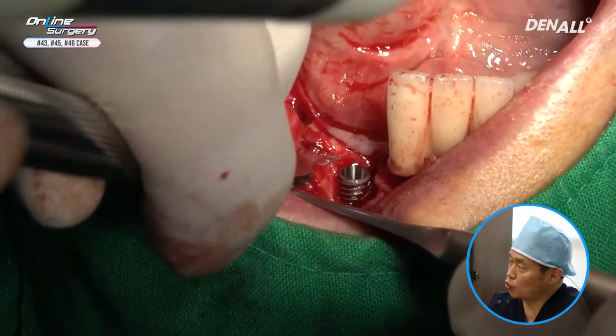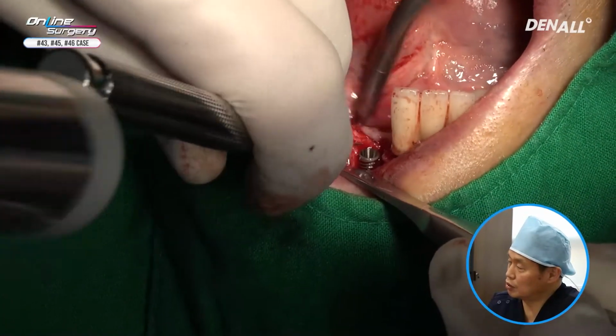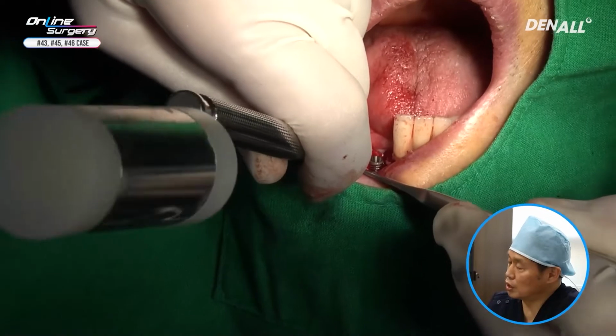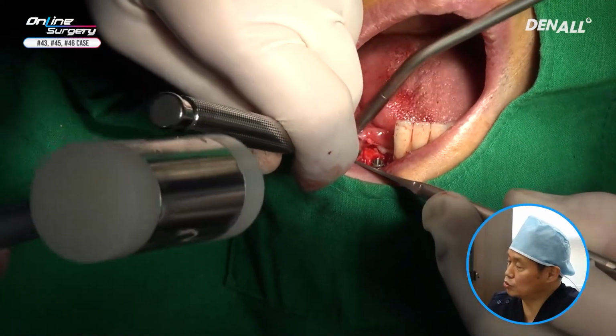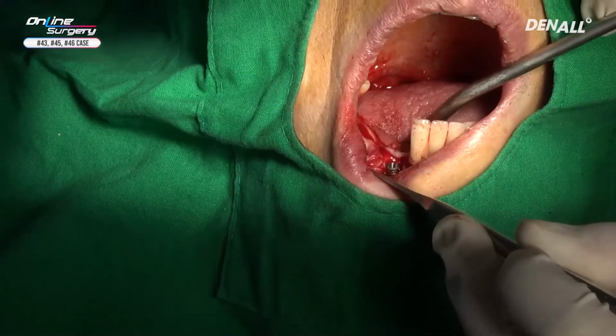On the back, you can see the alveolar ridge crest is being trimmed using a chisel. The alveolar ridge crest on the lingual side is unfavorable for the prosthetic process, so I'm trimming it a little bit. Remain still.